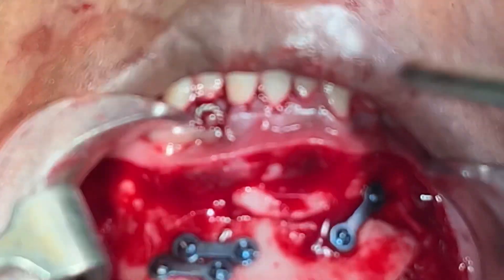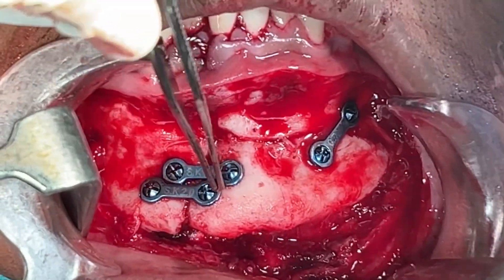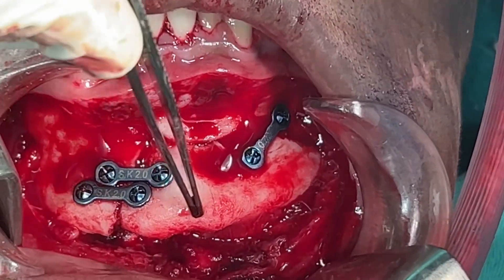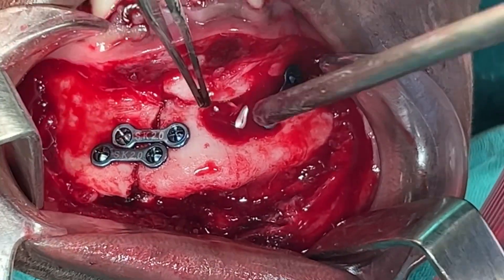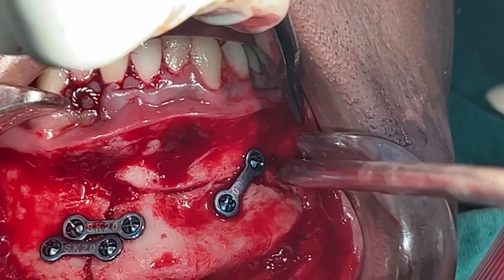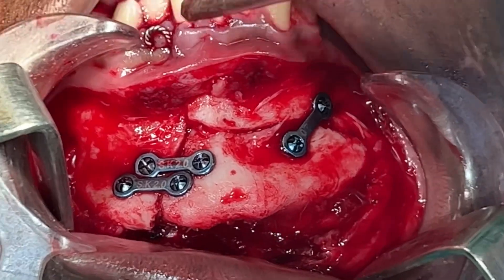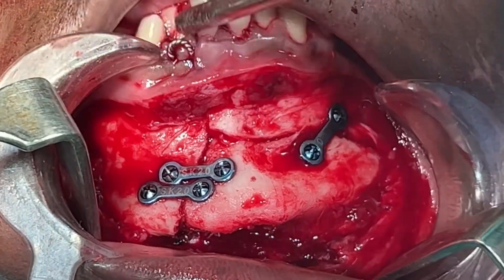We've just fixed this fracture segment. Let me show you the other area — we've used a two-hole plate to bridge the main part of the mandible onto the fractured part of the chin on this side, and similarly on the other side. Here we've used one plate, and the mandible is now intact. There is a small fracture line on the dento-alveolar segment between the teeth, and we've used wire to stabilize that.